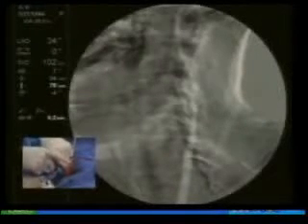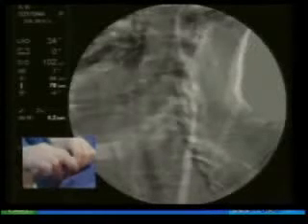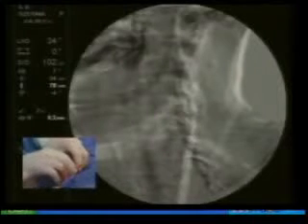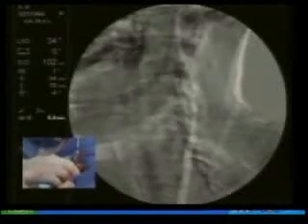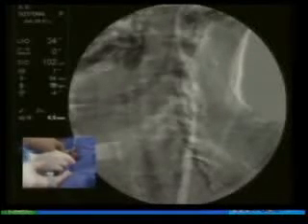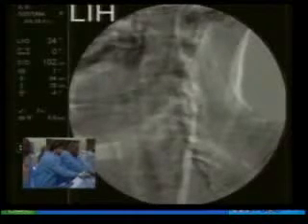And so since we have a stenosis in the common carotid, before he actually positions this, I'm going to inflate the common balloon. But do you think we ought to take a new road map since it's moved a little since we took that one before we start? Yeah, I think you should. Is that blurry to you, Chris? Blurry. Okay. So we're going to put it on road map. And before we do that, Ty's going to hook up with contrast. We'll take a road map, and then we should be ready to go.